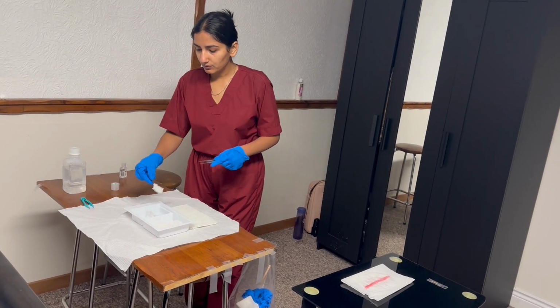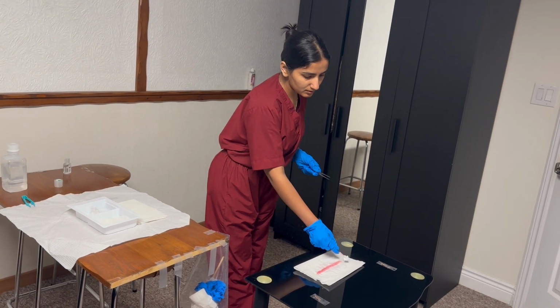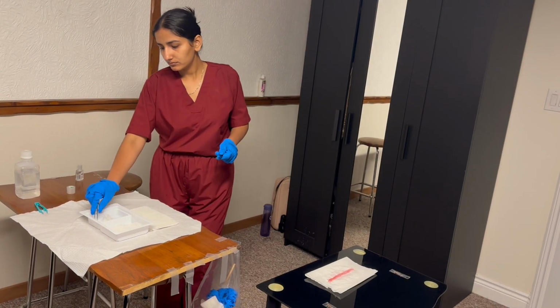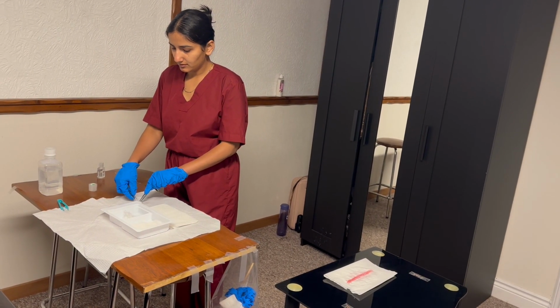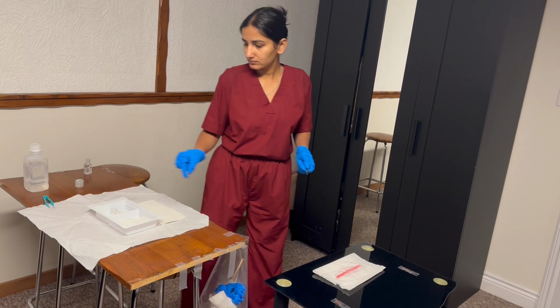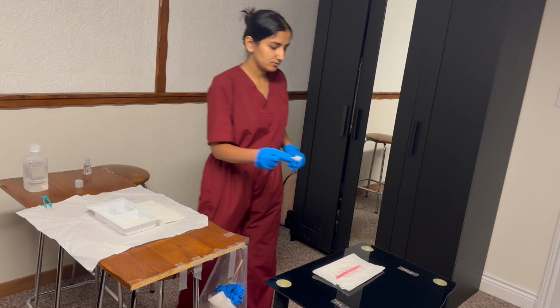Now I'm going to dry my wound as it's completely cleaned, taking a dry gauze. In the same manner, farthest from me. I will not care for this gauze, I will pick it afterwards. Closest to me. Taking third one to clean the midline.